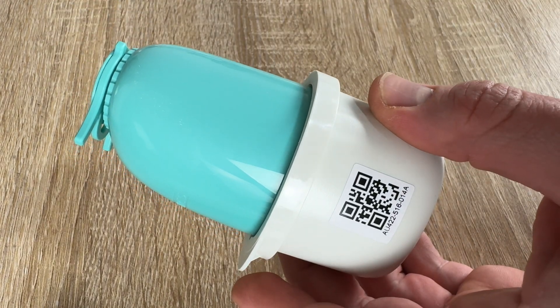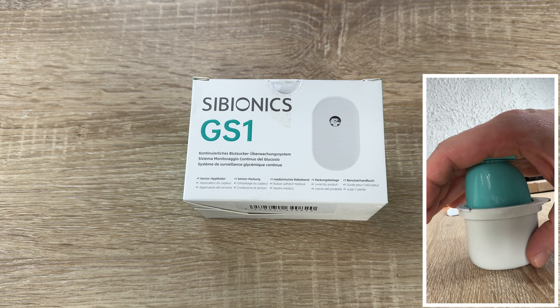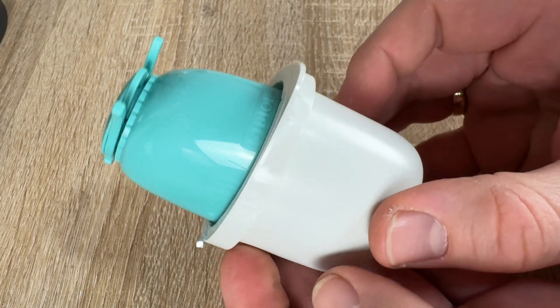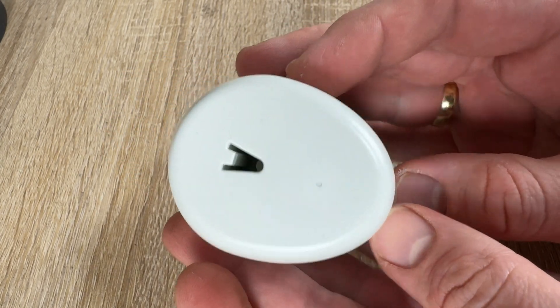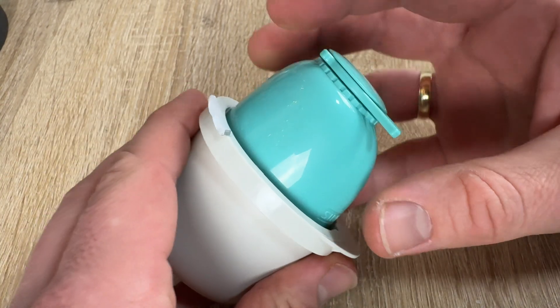You do not have to apply blood to the system to make a measurement — it is a continuously monitoring system. Traditional finger stick testing measures blood glucose levels at only a single point in time.